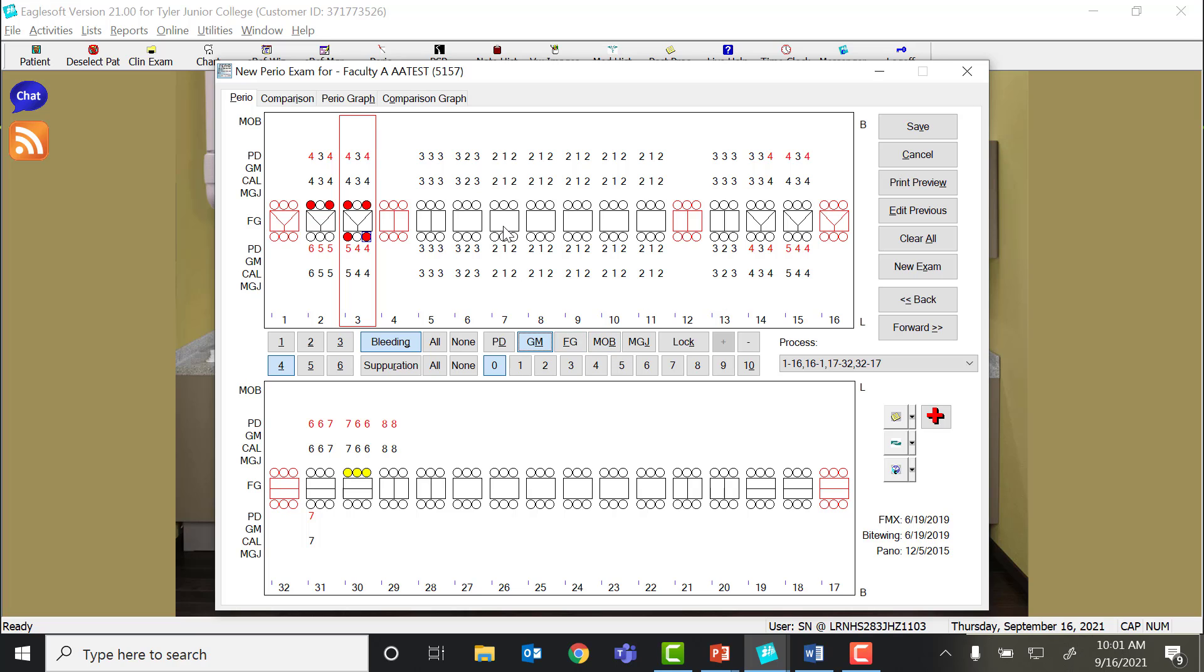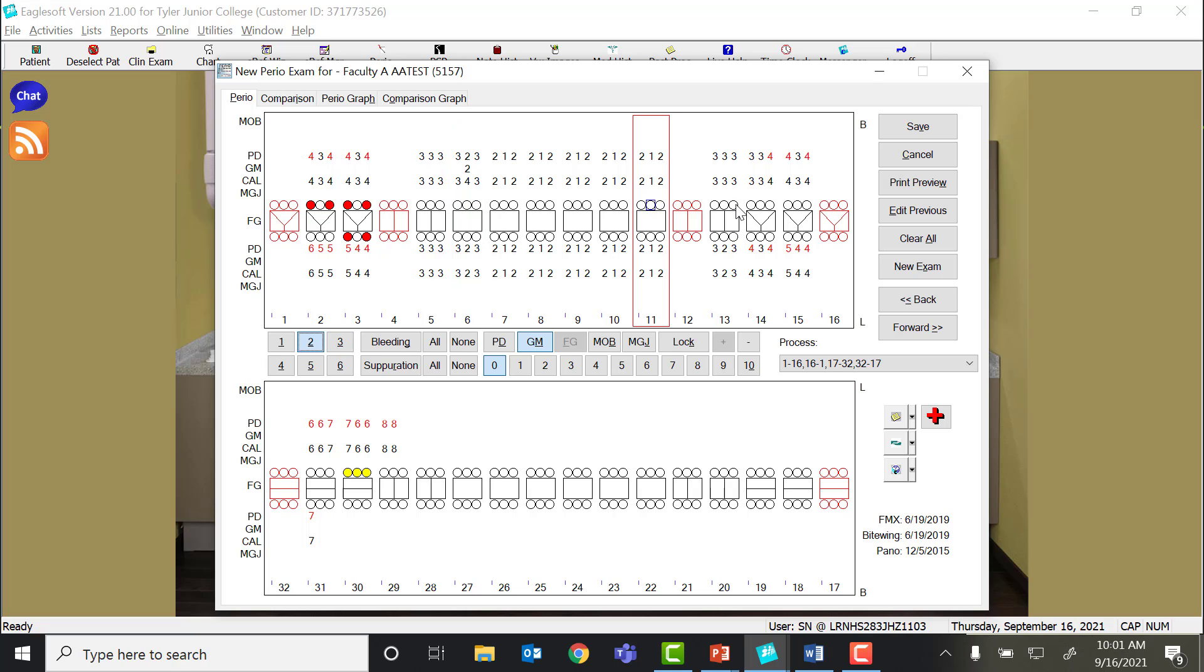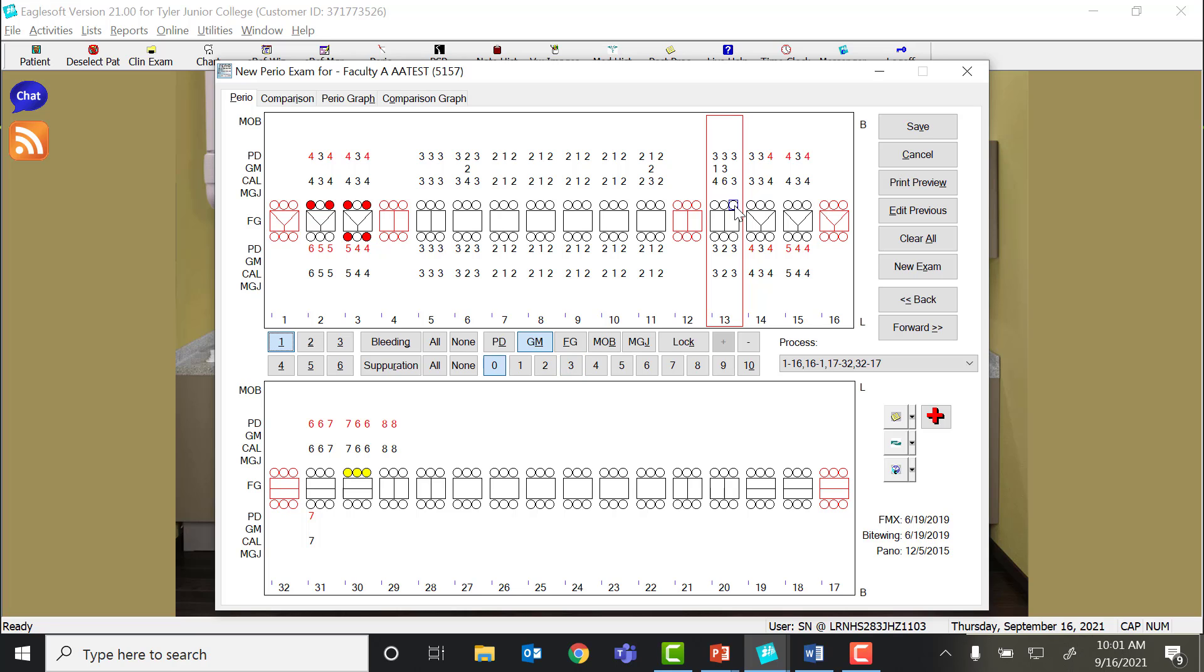So now on our maxillary, I'm going to click gingival margin, and we're going to say this patient has some recession right in the middle facial of number 6. We'll say they've got 2 millimeters. Same thing on 11. We have a hard brusher. We'll say 13 has a little recession around the whole tooth.